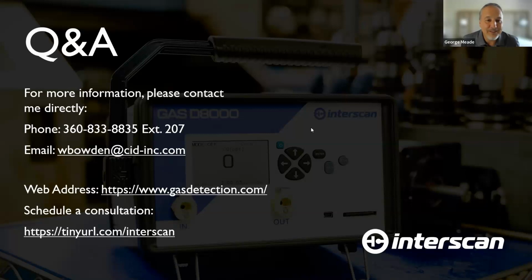And because this is a customer where we do training, they realized, hey, we're not running ETO. There must be something else going on. They contacted facilities, and they found out that work was done, and it set off. That's what caused the monitor to go off. Just a note about that, it used to be a bigger problem with the legacy gas sensors. The newer cartridge-based sensors now, although they still have interfering substances, are much less vulnerable to alcohols and ketones as the previous generation sensors were.